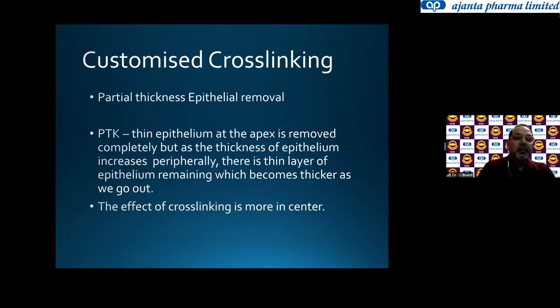The best thing is to remove it with PTK so that the central thin epithelium is removed quickly, and in the periphery some epithelial cells are still remaining, and then the effect of the cross-linking is more in the center, thereby giving a much better effect.